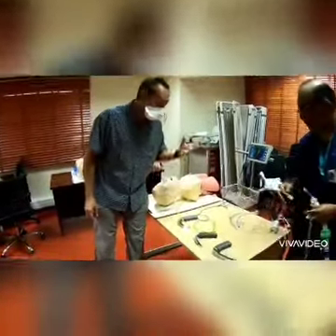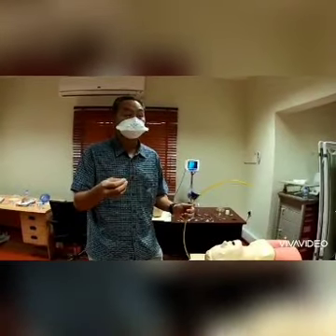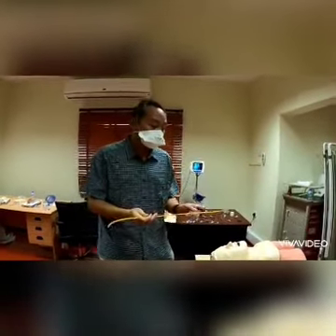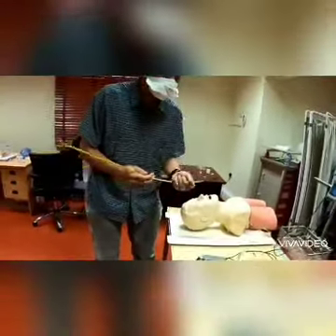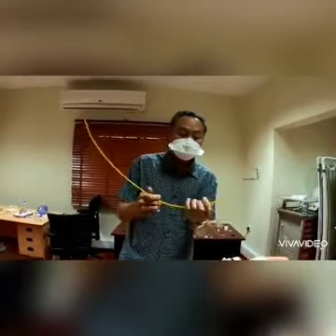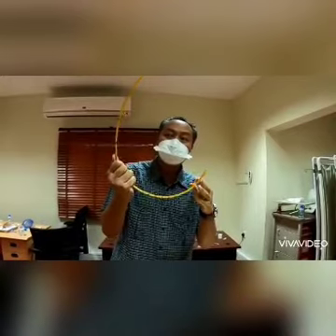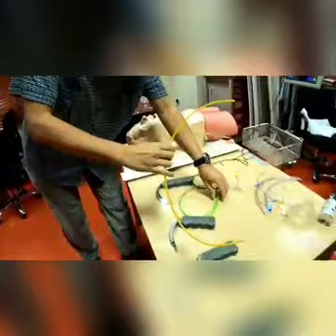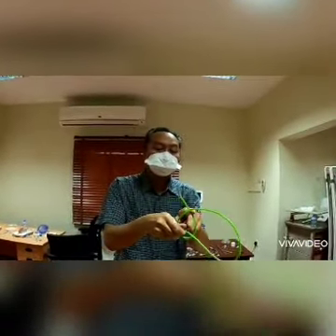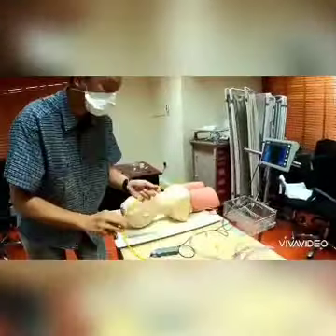If you are predicting a narrowed airway or a difficult airway, you may decide to intubate using a bougie instead of a stylet inside the ET tube. If you want to use a bougie, make sure you get a bougie with enough memory. What I mean is that when you bend the bougie, it will remain relatively bent. That's what you need, a moldable bougie. What you don't want to use is a bougie that has no memory. In other words, you try to bend it, and it will straighten up like a spring. You don't want this kind of bougie because you'll almost certainly fail.